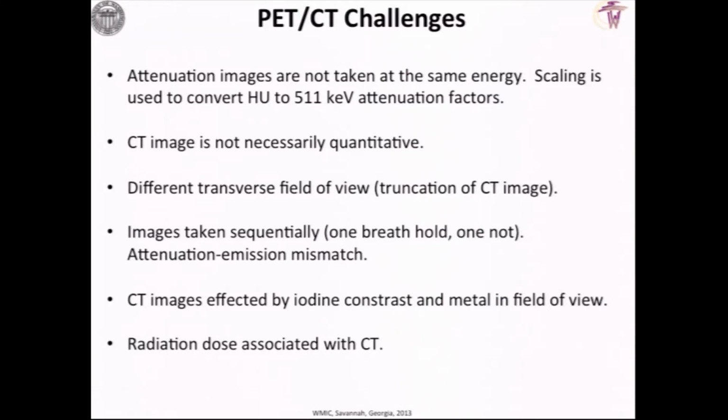The images are taken sequentially and over different kinds of time periods. The CT images in general are going to be a breath hold image. With PET, the patient is freely breathing. So there's potential for mismatches of the attenuation and the emission data, which can lead to artifacts in the images.